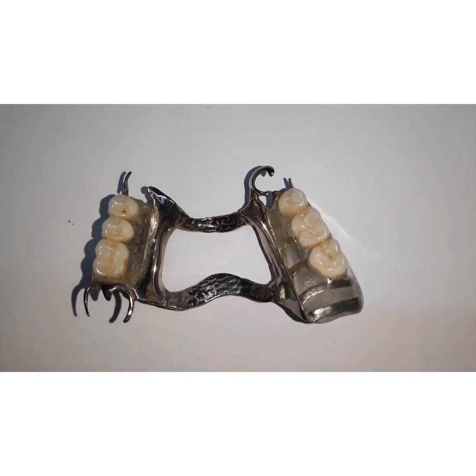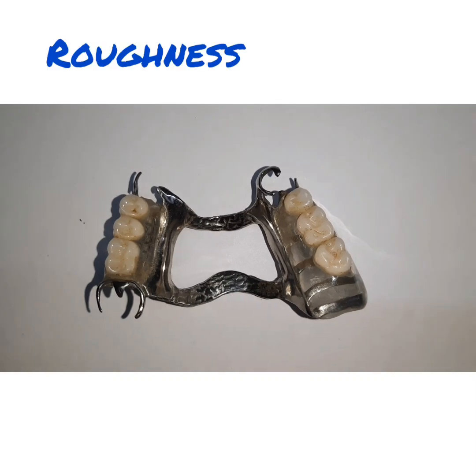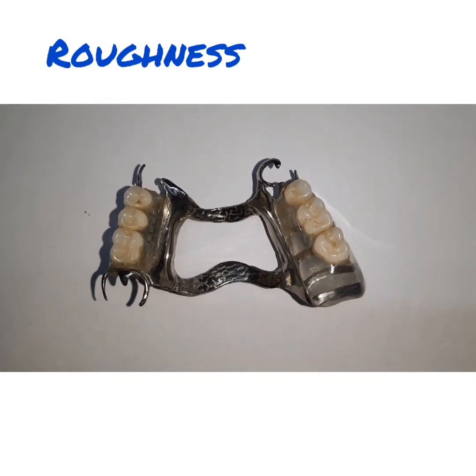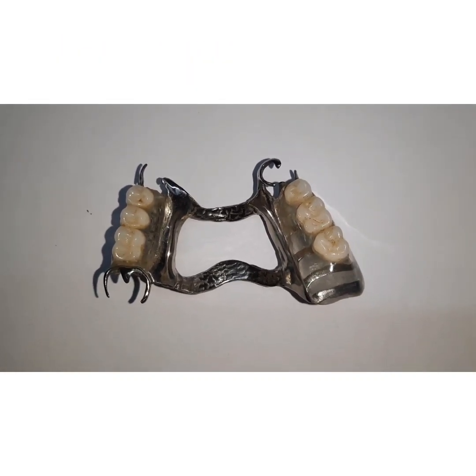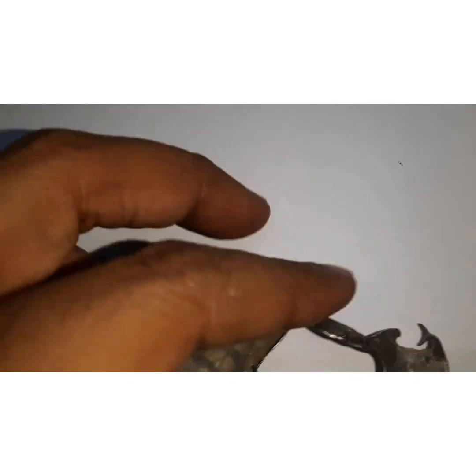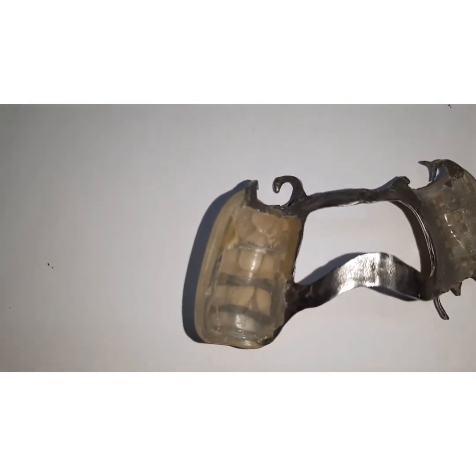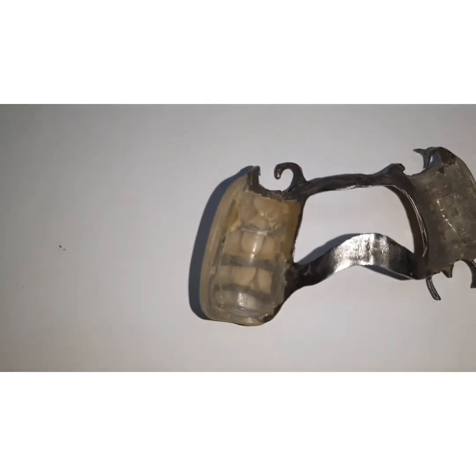Next problem can be on the tissue side of the denture base, where the patient complains of roughness. Now you have to identify a particular place on the denture surface, that is the tissue side of the denture, and check for any roughness there. You may find it difficult.